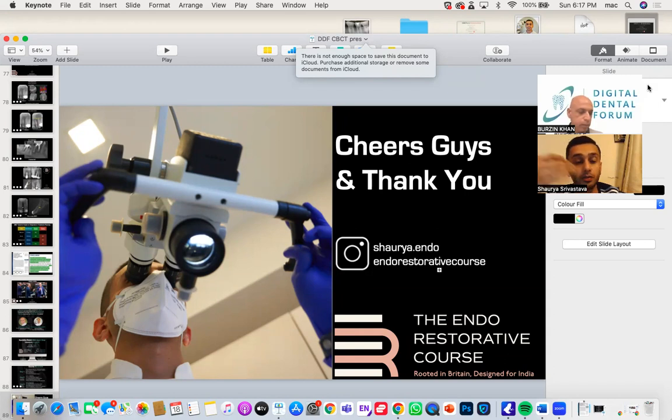For example, if you're looking at an extensive lesion, is there a pocket associated with it? Are there intrabony defects? Is the perio stable? That will differentiate whether it's a fracture, the path of least resistance, or an endoperio lesion. Radiologists don't know.